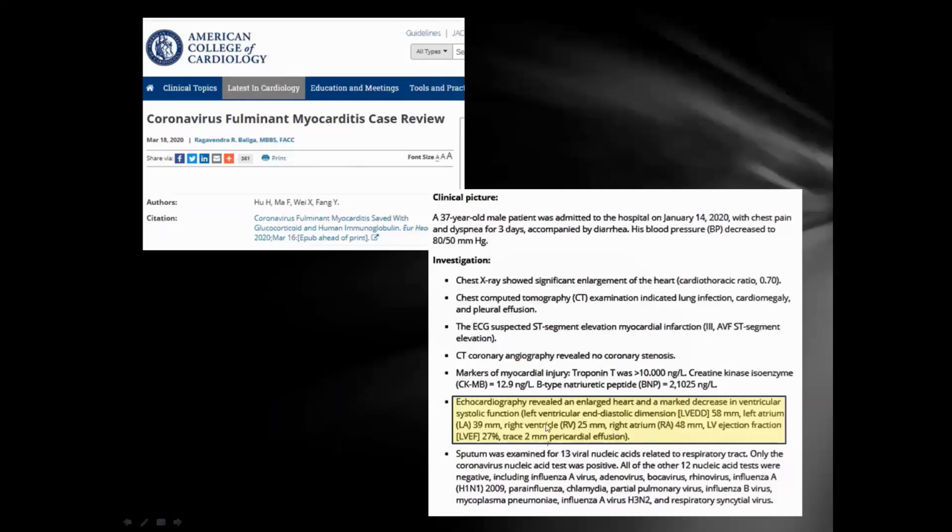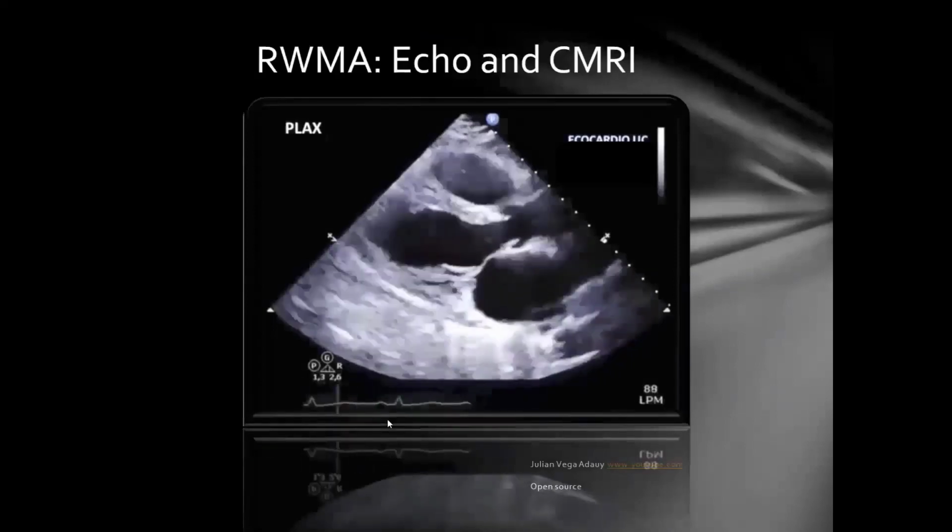So again, you may have either and/or some of all, but it's going to be variant. So the main thing for us is to get the pictures so that all this can be evaluated without sitting there taking a million pictures while you're in the room with these patients. And we're going to talk about that at the end of the presentation.